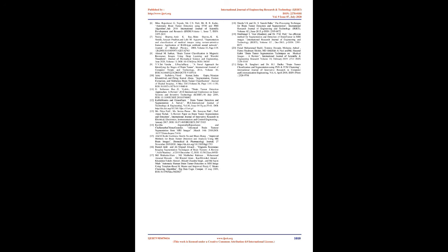Advantage: easy to understand. Easy to observe similarity in data. They can be trained in a short period of time. Disadvantage: requires necessary and sufficient data. Often difficult to obtain perfect mapping.